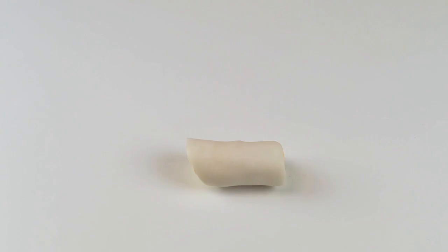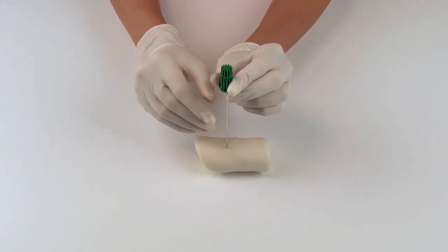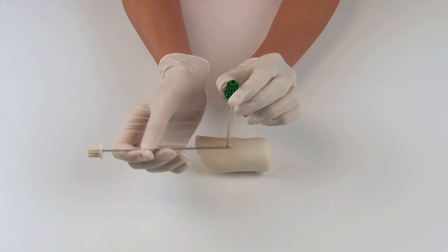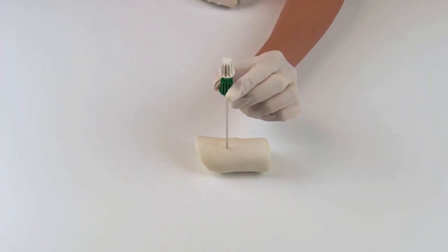To begin the procedure, administer local anesthetic at the puncture site. Make a small incision with the scalpel to make the penetration of the skin easier. Now, press the penetration cannula firmly down until the tip reaches the bone. Remove the stylet while holding the penetration cannula firmly against the bone to maintain the position. Insert the eccentric drill into the penetration cannula and rotate it a few turns until the drill tip catches the bone. Verify the position and direction of the drill with diagnostic imaging. It is easy to correct the position and direction at this point.